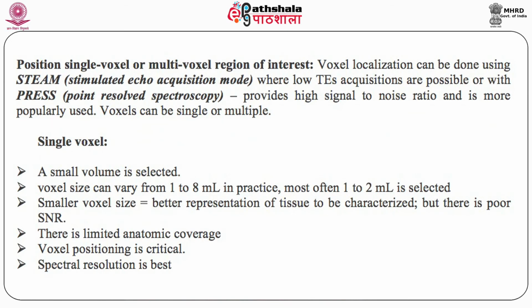Steps of acquisition. Firstly, a localizing sequence to identify the area of interest is required, which is generally a T2 or a FLAIR sequence. Post-gadolinium contrast images are used only if absolutely necessary. Use the best sequence where the pathology is best demonstrated.